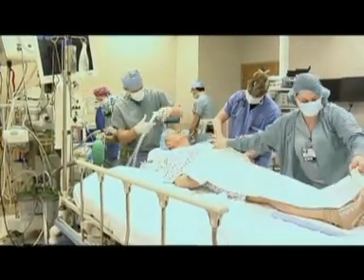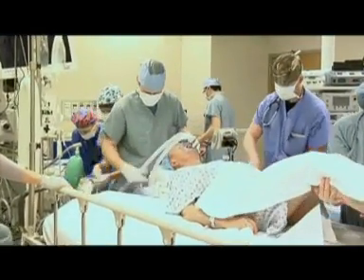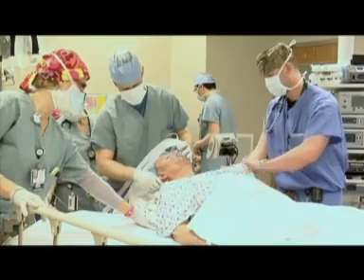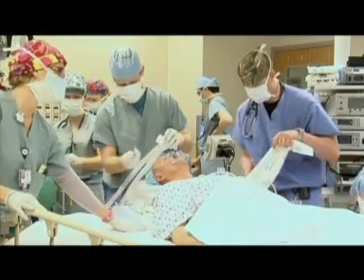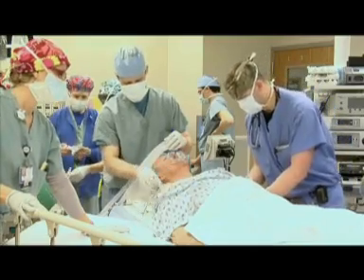Upon arrival to the operating room suite, the patient is prepared in the routine sequence, having already received intravenous anxiolytic and opioid medication. Standard American Society of Anesthesiologists monitors are applied, including electrocardiogram, non-invasive blood pressure, and pulse oximetry.